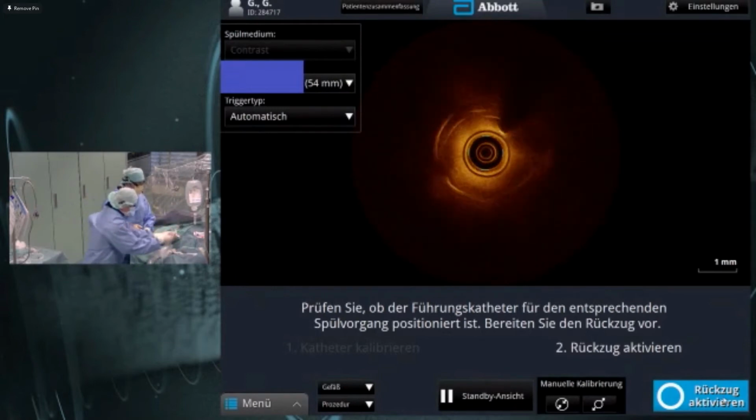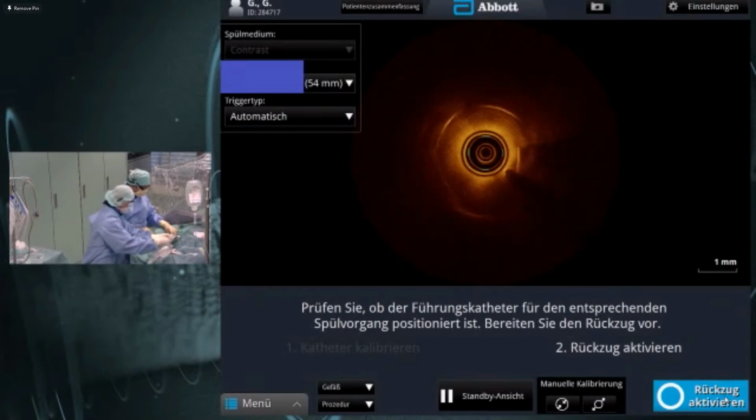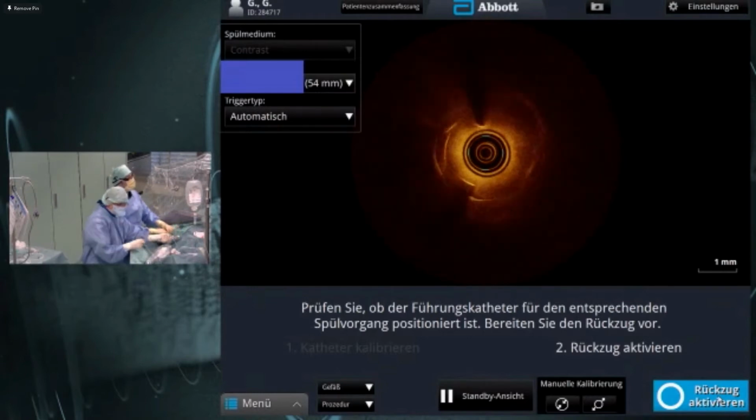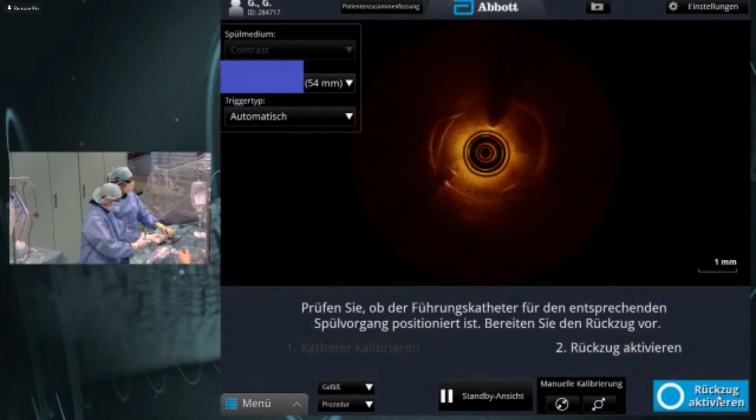Okay, so anyway, we put some multiple millimeters of stent in, and so this little bit of metal, it's not a big deal for us. So we need some contrast media, and then we can show you the final OCT imaging. And yeah, wir sind bald fertig.